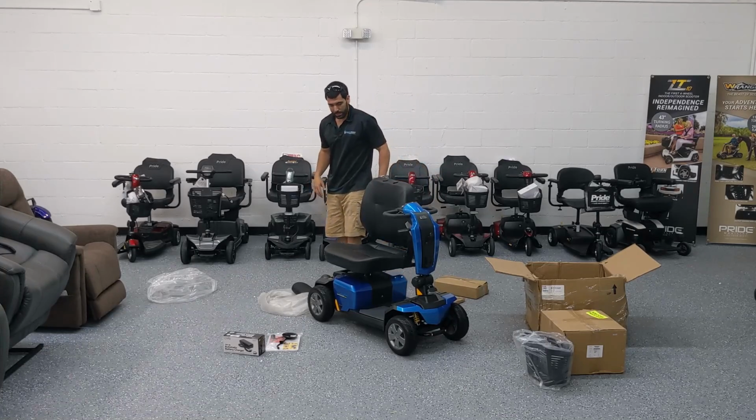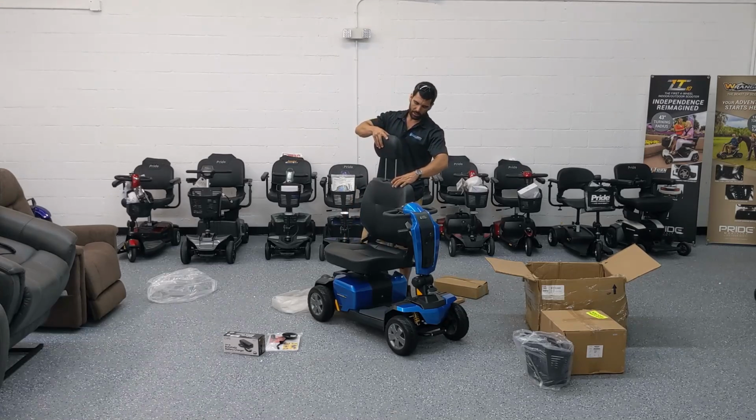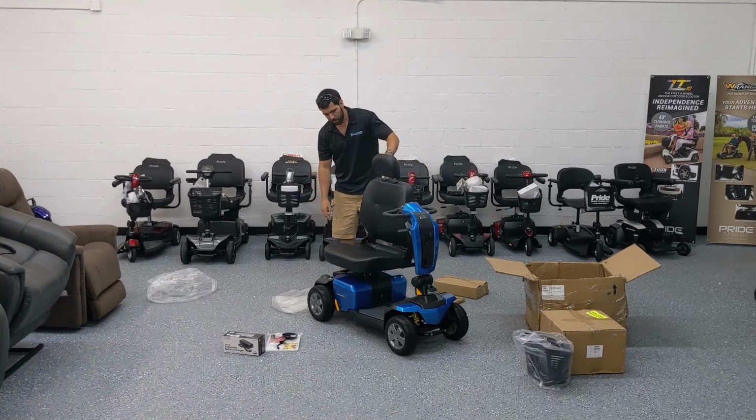And same thing with the headrest. You can, just like a car seat, there's a little lever here which you push to kind of let it slide in, and then you can adjust the height with that lever, which we'll zoom in on here in a bit. Very easy to use, just like a car seat.